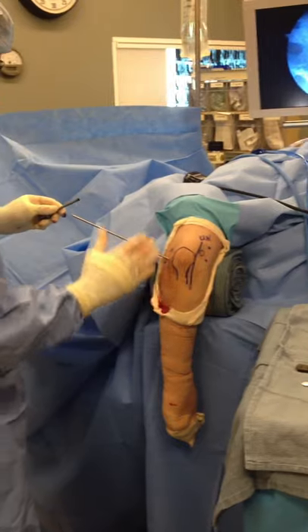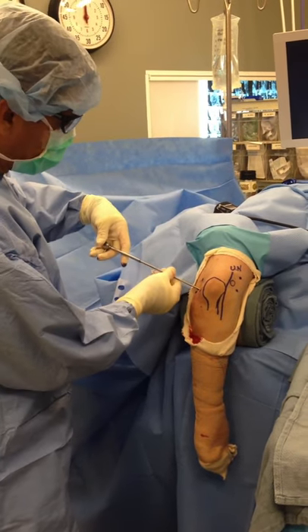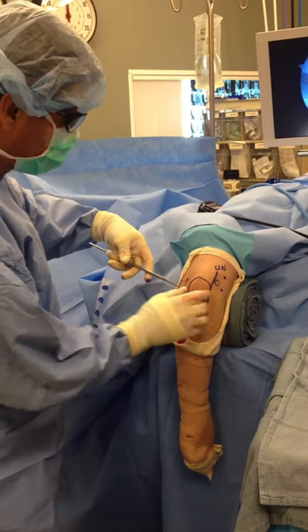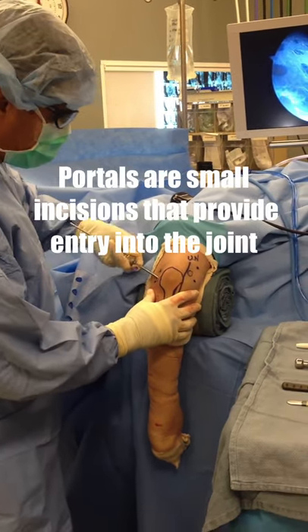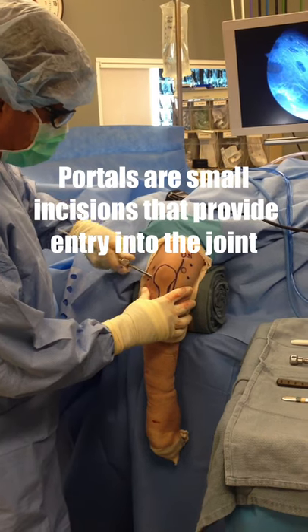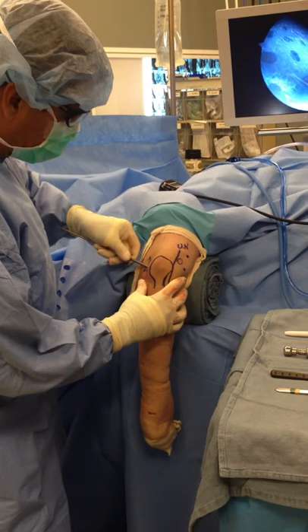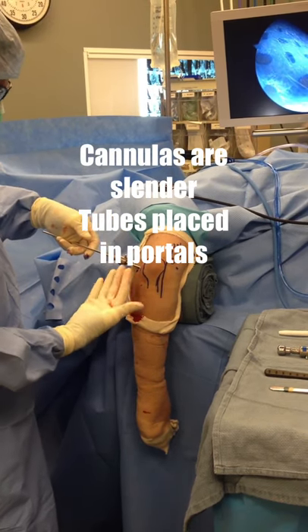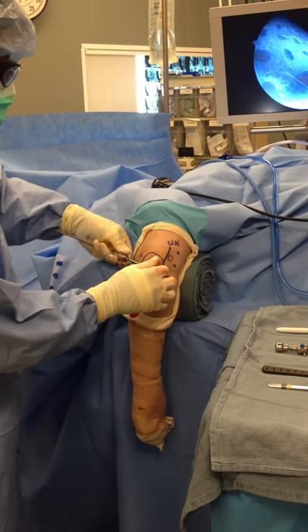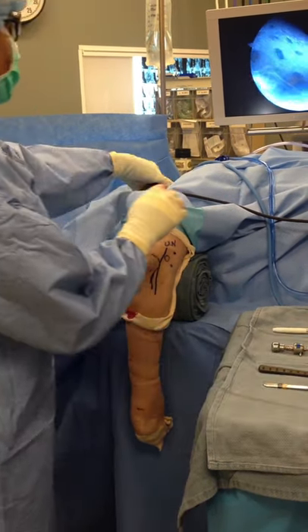Now we're establishing our lateral portal, the anterolateral portal. We're going to jump in the cannula. So we're in the joint, so I just really come out. Now we're going to go with the scope.